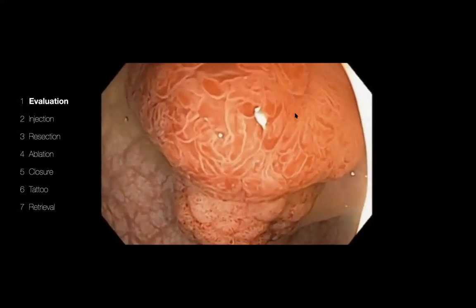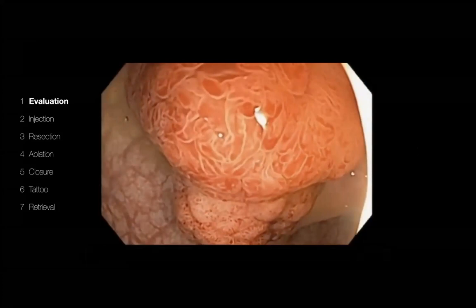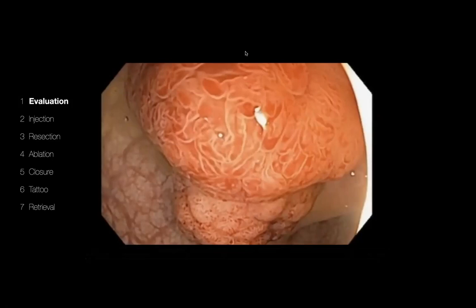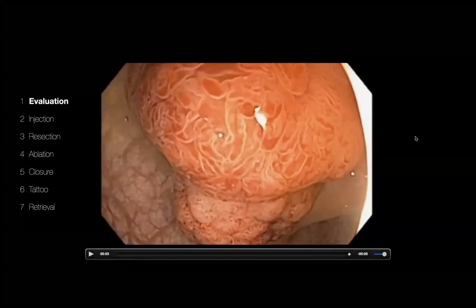So I can't visualize a pedicle. To me, this is indeed a large sessile lesion. And if I look to the macroscopic appearance of the epithelial surface, I see areas with white tubular structures surrounded by brown structures, so compatible with adenomatous tissue. But from 9 to 3 o'clock, I see typical villous appearance. So this might be a tubulovillous adenoma. And of course, we can't differentiate between low and high grade dysplasia. But in my opinion, there are no visible areas with amorphous pattern or no other signs of submucosal invasion. So I think that this is a sessile tubulovillous adenoma.